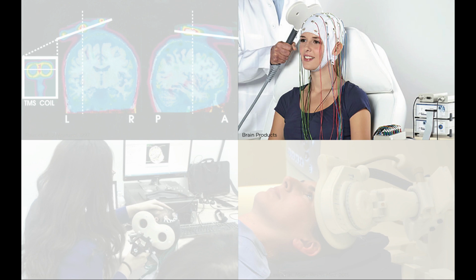Originally, the EEG electrodes are ring shaped, and when you put a TMS coil on top of them, they will couple to the magnetic field from the coil, and it will result in ohmic heating. And so the EEG electrodes in a TMS-compatible system are slotted, which means that they do not form a closed circle, but more of a C shape. This way you reduce the eddy current generation by the electrodes.